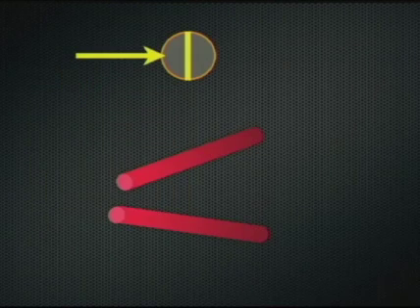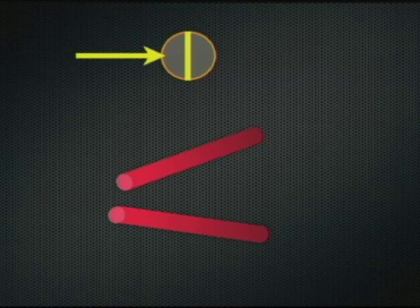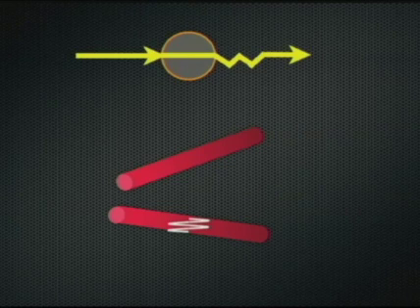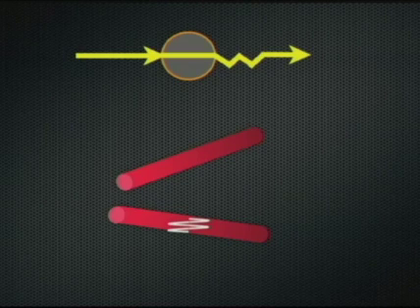Doppler works very much in a similar fashion. If we have two vessels and are only interested in capturing the Doppler information from the deeper of these two vessels, we can send out an ultrasound pulse. We can tell the machine not to process the echo from the first vessel, but only to process the later echo coming from the second vessel. Simply by using controls to indicate the time interval that we wish to wait before we process the signal, we can selectively position a Doppler sample volume at any site within a structure that we desire.